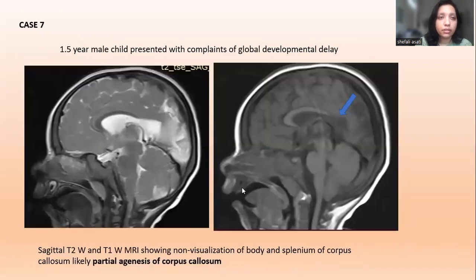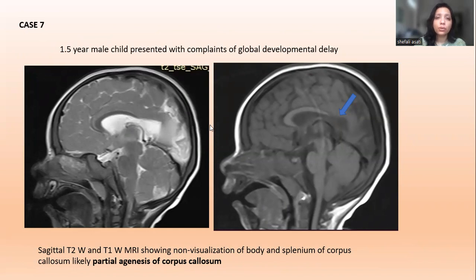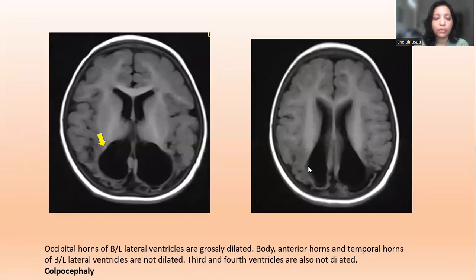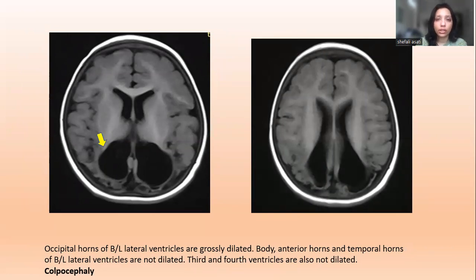Case 7: A 1.5-year-old male child presented with global developmental delay. On sagittal T2-weighted and T1-weighted sections, there is non-visualization of the body and splenium of the corpus callosum, likely partial agenesis of the corpus callosum. In the same patient, the occipital horns of the bilateral lateral ventricles were markedly dilated, while the anterior horns, body, temporal horns, and third and fourth ventricles were non-dilated — diagnosis of colpocephaly.